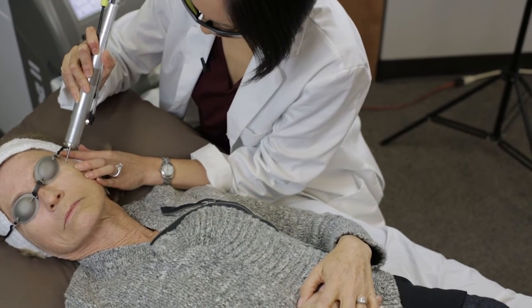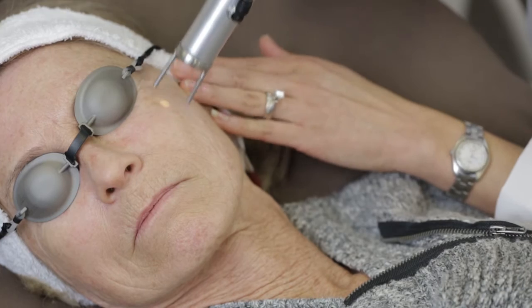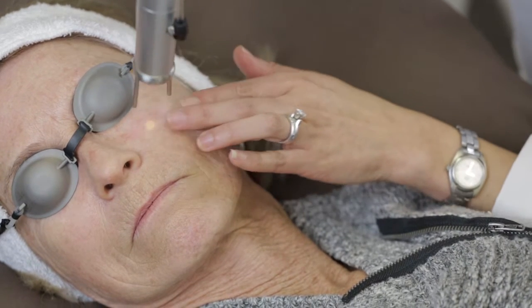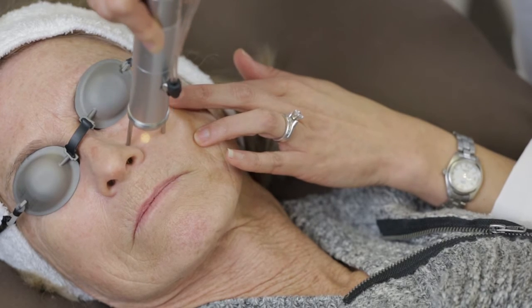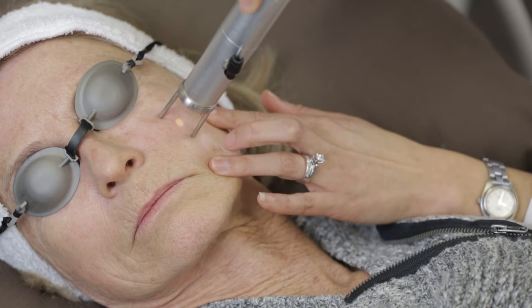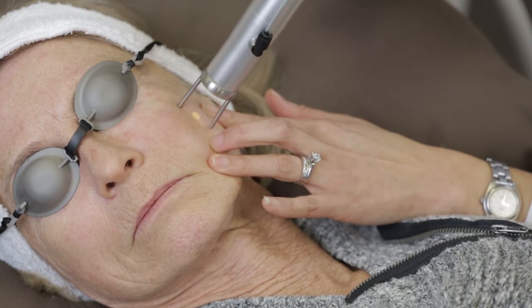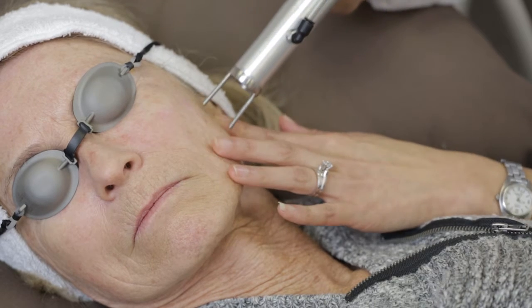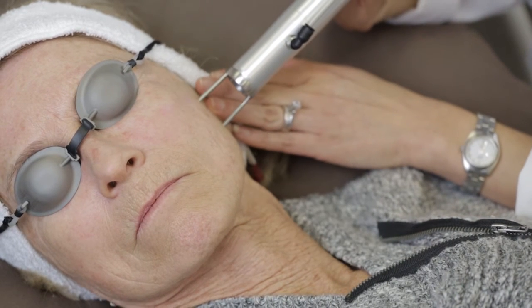What I'm doing is actually treating the entire surface area of the face. You can spot treat brown spots or hyperpigmentation, but I have found in my experience that it just works better to treat the entire face. You actually end up getting areas where you didn't even know pigment was there to come out.